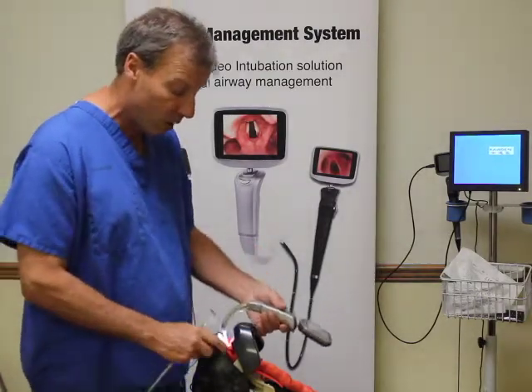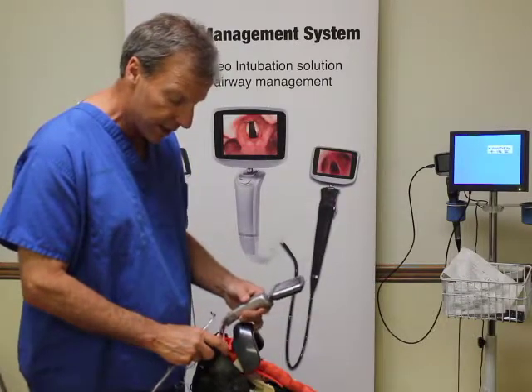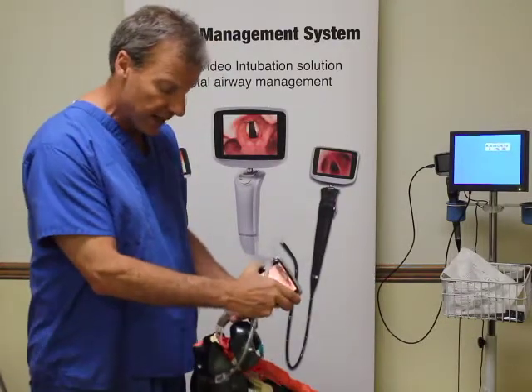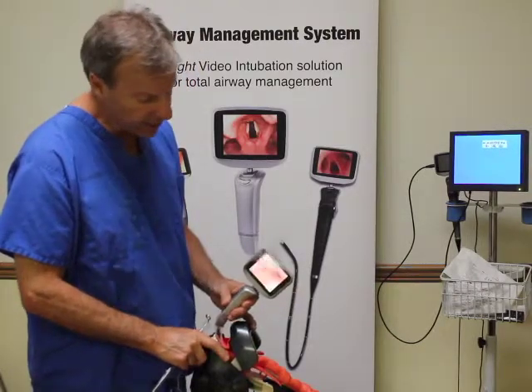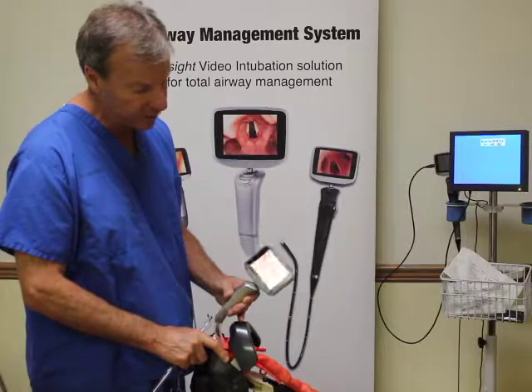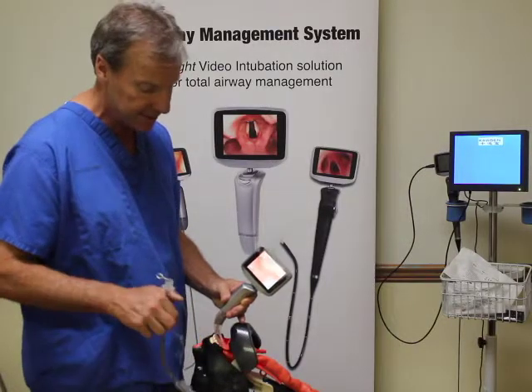The first step would be to watch your patient and watch the end of the endotracheal tube go down the center line basically. And when you get to that point, then you look at your display. The ideal view of the vocal cords is to see the vocal cords off in the distance.